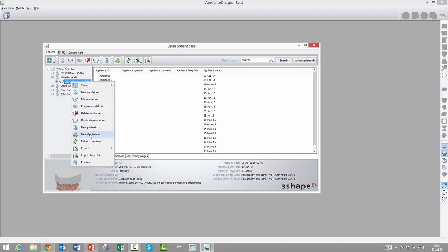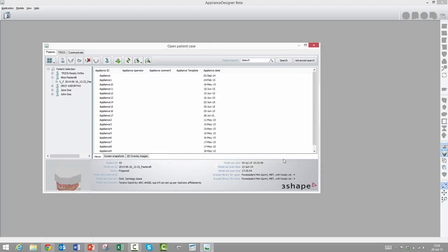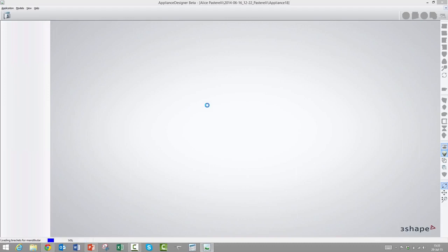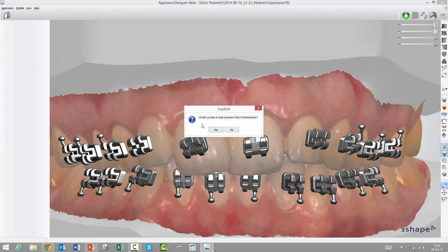What we'll do now is that we will right-click on it and then choose to make a new appliance. We could change the naming here, but other than that we will just go on and press create. Now we can actually see here in the lower left corner that it's loading the brackets.